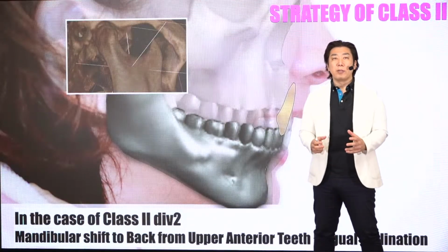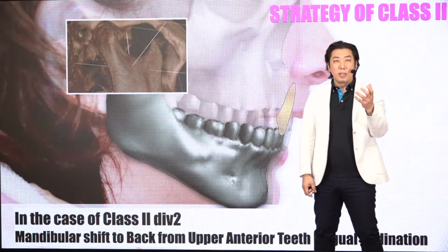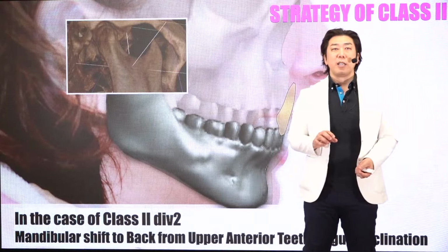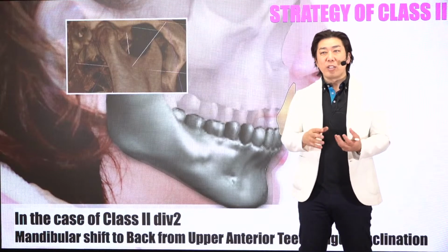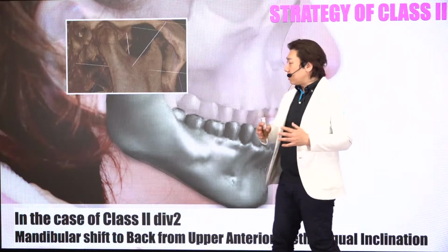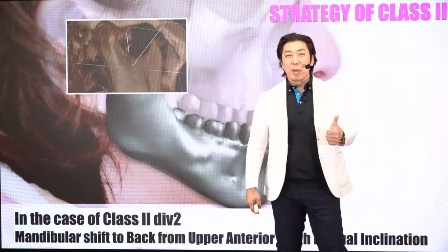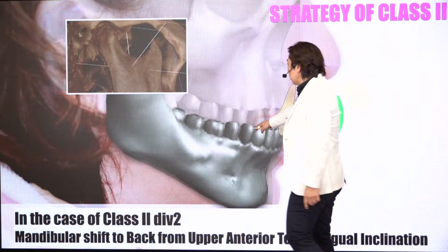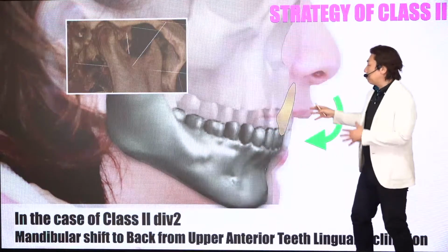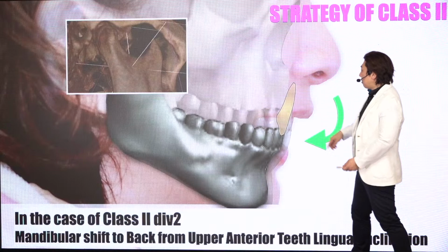So we have to think about everything. Orthodontists think about everything: the joint problem, position, guidance, everything. Many doctors focus only on ClinCheck. The ClinCheck management is good, the ClinCheck staging is good, but this is only part of aligner orthodontics. We have to think about everything because the patient is not only teeth. The patient has pain, muscle, bone, and joint, right? Initially we have to think about the position of the condyle, right? Then my decision is the problem is here.